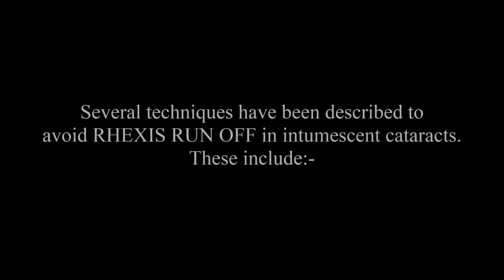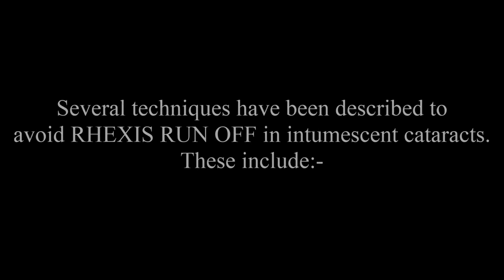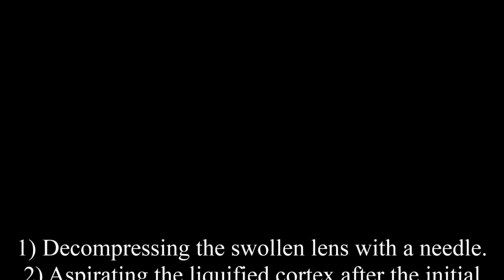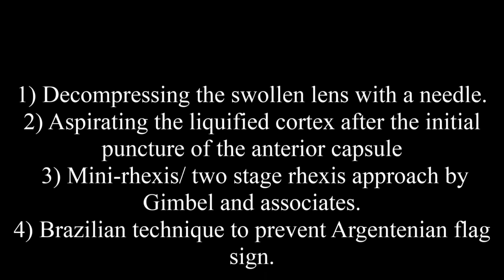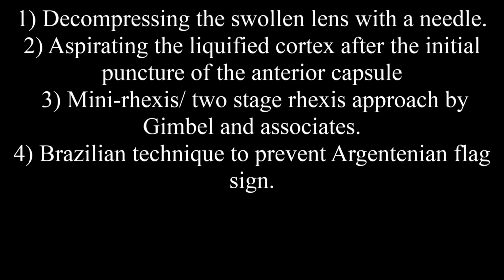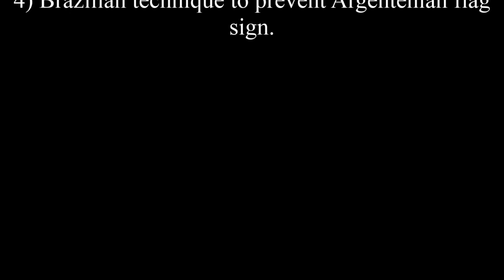Several techniques have been described to avoid rexis runoff in intumescent cataracts, such as decompressing the swollen lens, aspirating the liquid cortex after the initial puncture of the anterior capsule, mini rexis or two-stage rexis, and so on. We present our novel technique to create CCC in intumescent hypermature cataract using bimanual irrigation and aspiration.